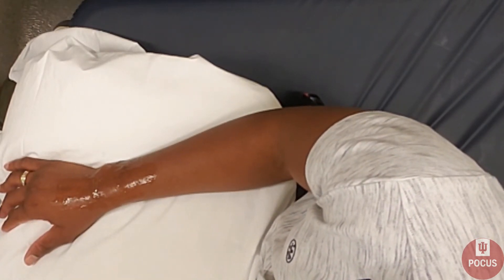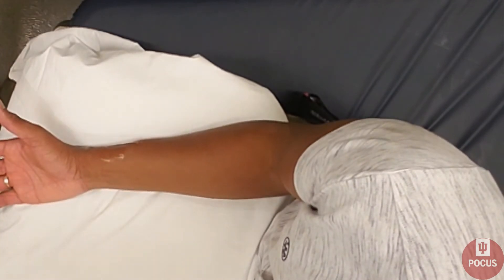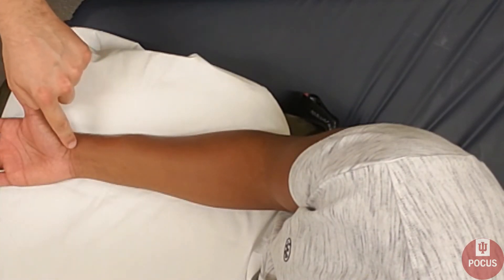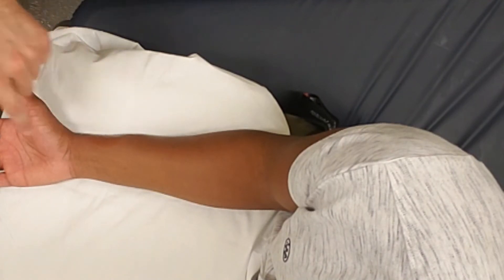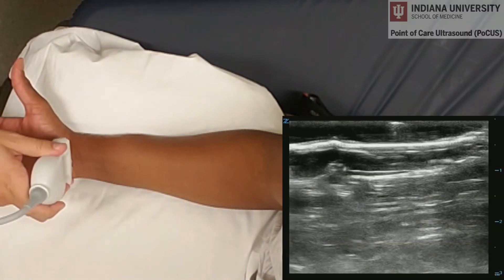Next, we'll have our patient supinate his hand so we can evaluate the volar side of the wrist. First, we start at the distal wrist crease, which is the carpal tunnel inlet.